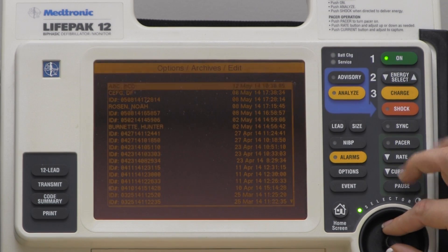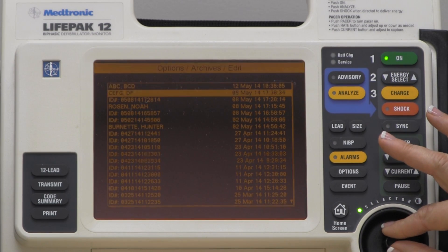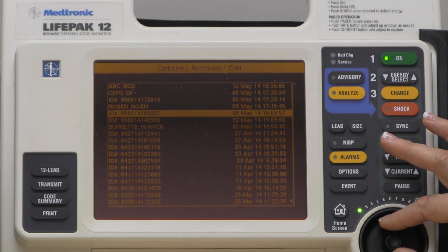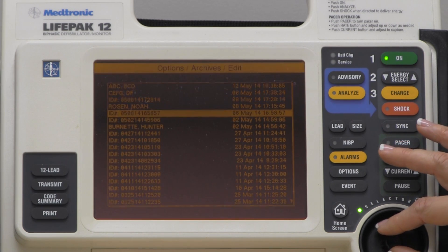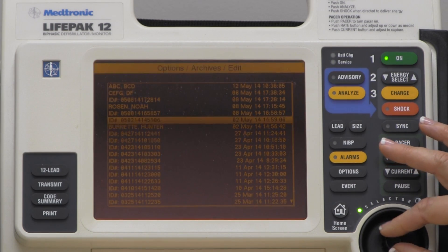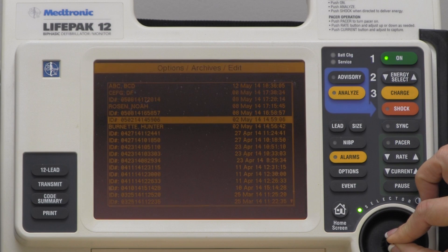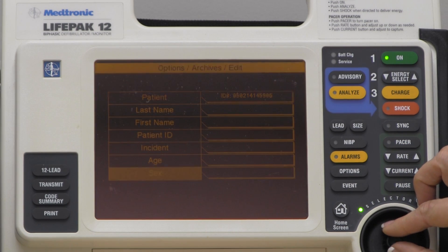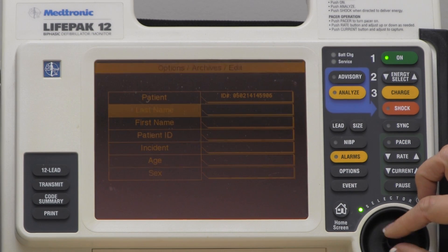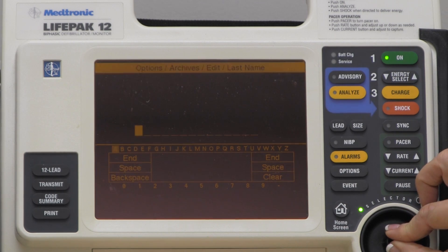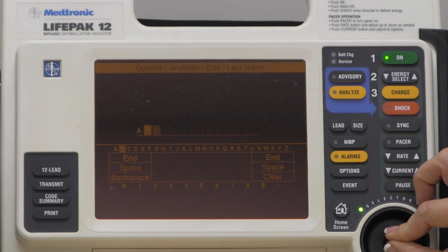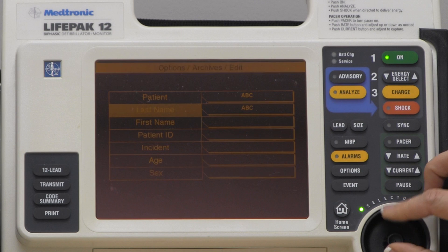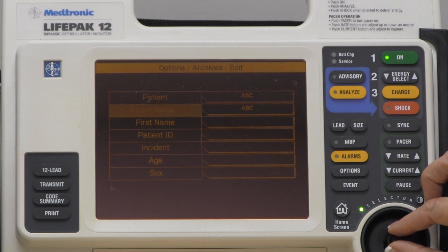This will only work if nothing has been put into the patient name — last name, first name — category. I will select the call and then put in the last name and then select first name.